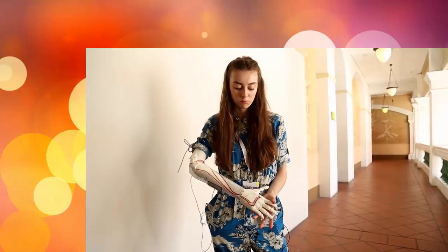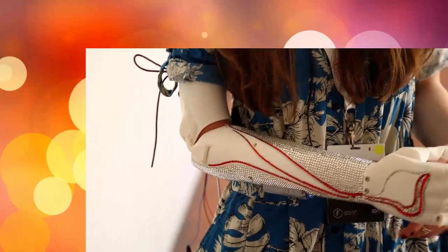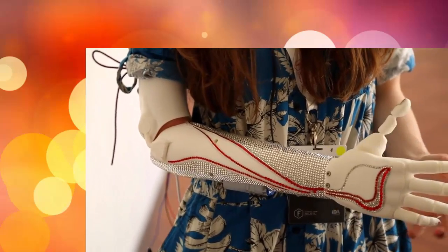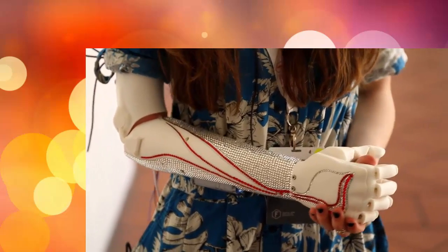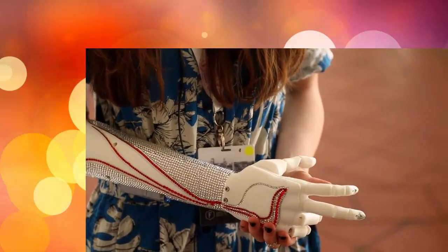Bionic hands can cost anything from £30,000 to £100,000 — they're really super expensive. And so even though it is a very amazing, life-changing technology, only very few people get to have it. We want to sell the same functionality in a different form for under £1,000, with user testing and field testing this summer, and then have it on sale within a year.